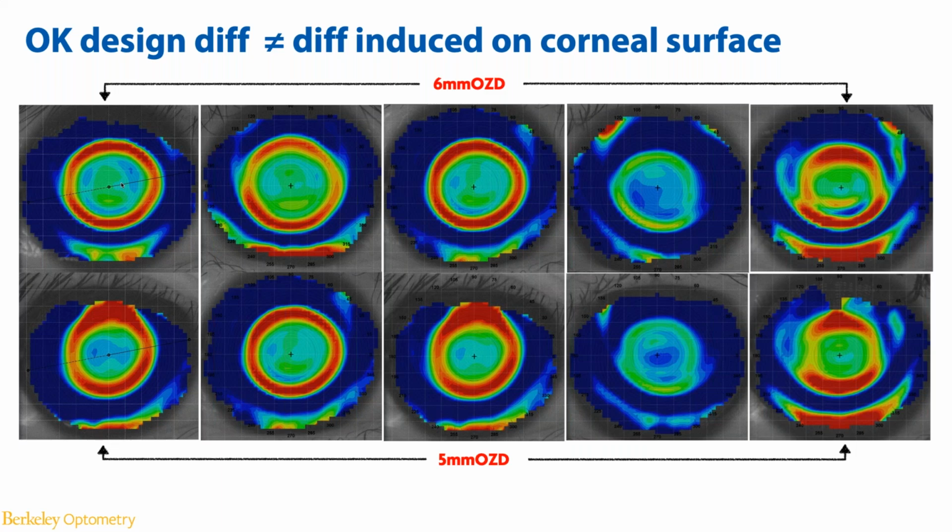Excellent, thank you. And another question in terms of fitting the 5mm design, because the extra 1mm that was essentially taken away from the width of the optic zone was then redistributed to the landing zone angle zone of the lens, do you change how you fit the landing zone because you're utilizing a 5mm OZD?